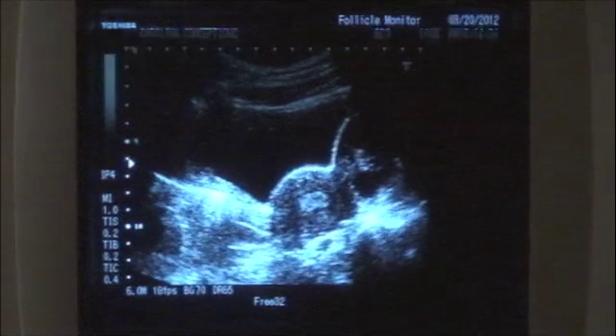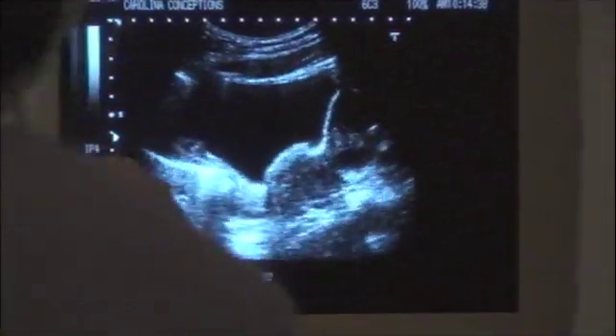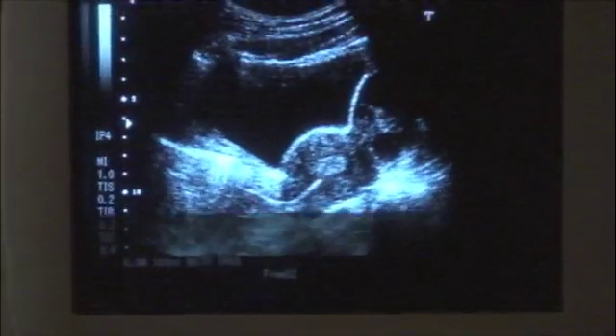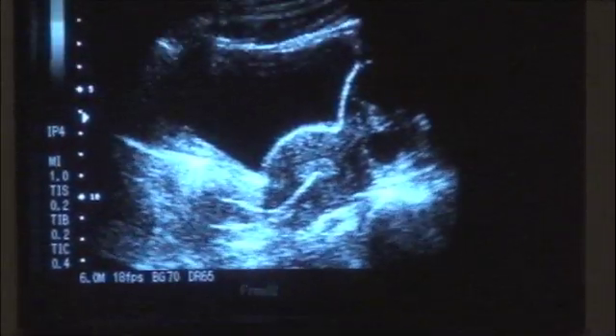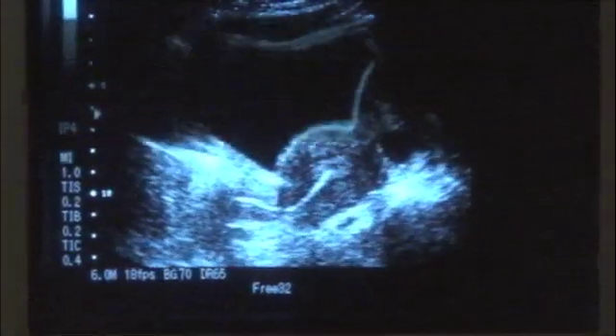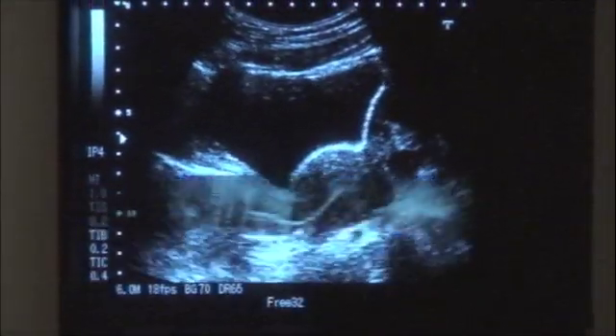You'll see on the ultrasound screen that the catheter comes in as a white appearing line from the left side, and you can see the nurse Michelle pointing from the left side up into the uterine cavity. You can see the circuitous route that the catheter actually takes, and that's why we think ultrasound can be very important in guiding the placement of the embryos.